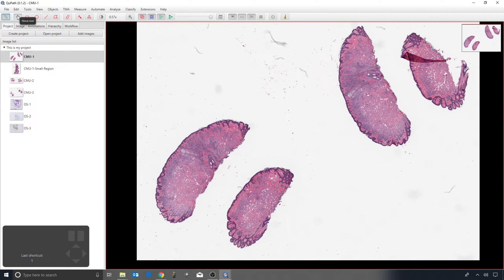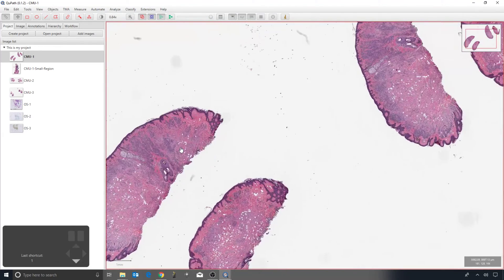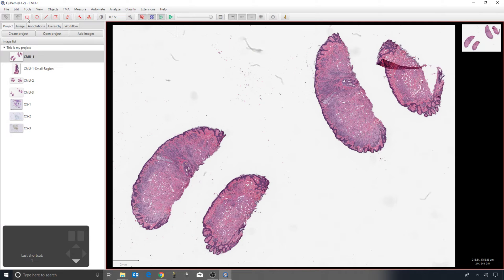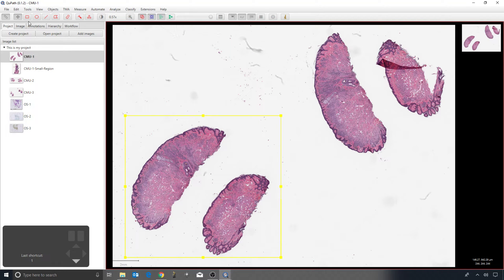The next one is the move tool, which is activated by default. If I click on the image and drag, that changes the field of view and allows easy navigation. If I choose the rectangle tool, clicking and dragging creates a rectangle instead. After drawing the rectangle, QuPath automatically brings me back to the move tool — because without that, I was accidentally drawing rectangles whenever I just wanted to navigate.